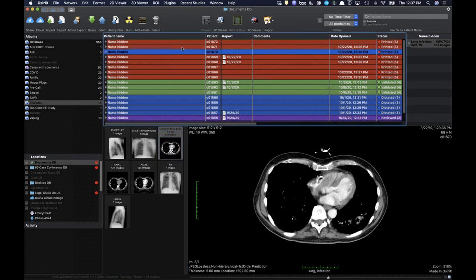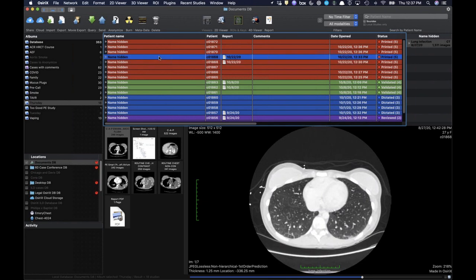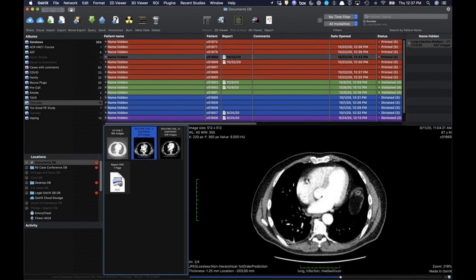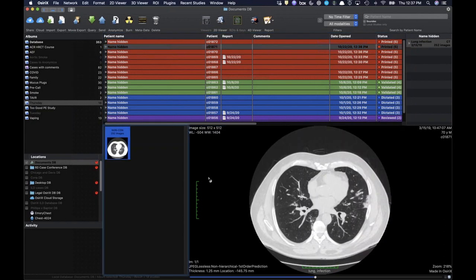Yeah. The first case, it seemed like it wanted to go towards the mediastinum, like around the pulmonary veins. Right, exactly. It didn't seem like it was fibrosing. It was around the pulmonary vein, but it wasn't really doing anything significant there. Yeah, like right in here. And I don't know, is the calcification the immune response to the histo, that for some reason it incites a different immune response than other infections? I don't know, but it's kind of cool.